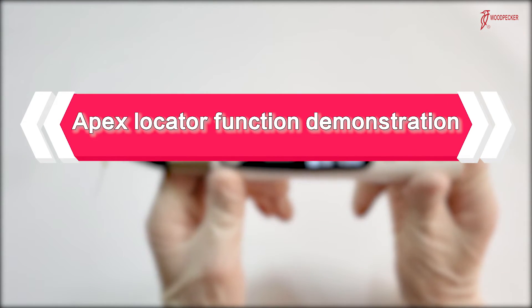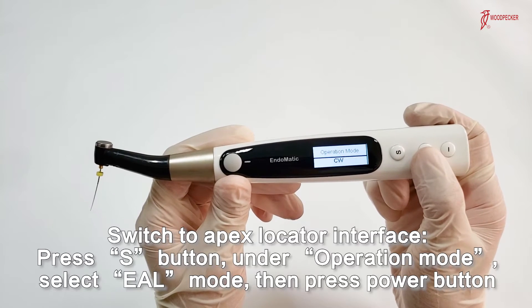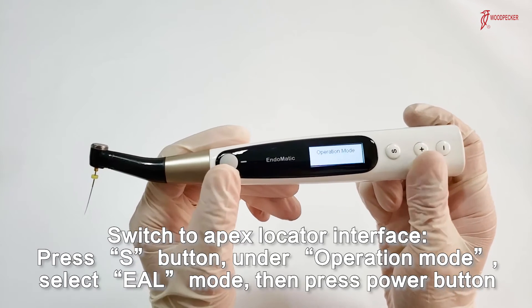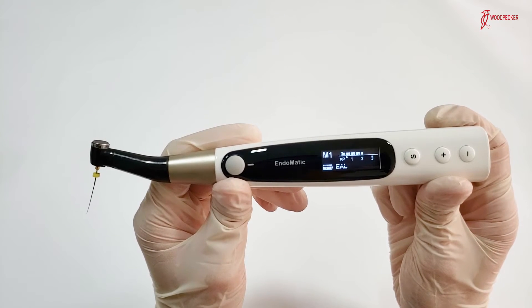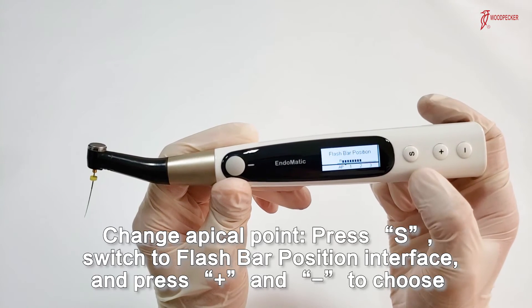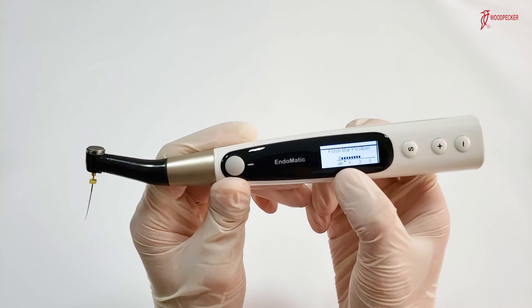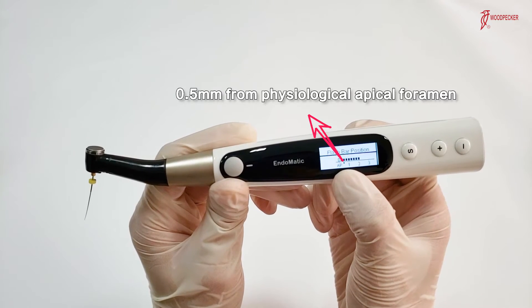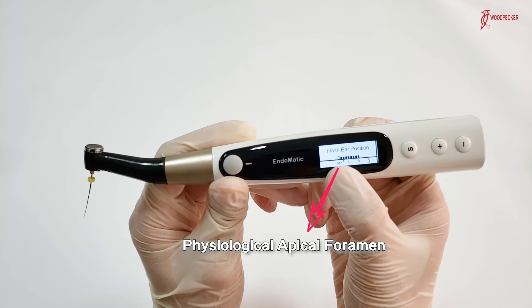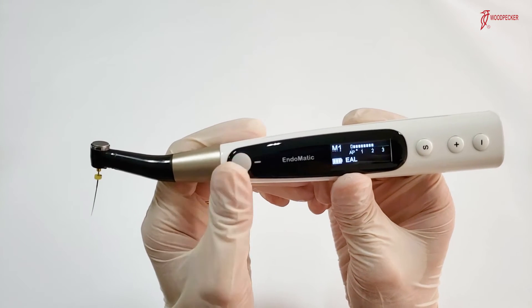Endermatic has an apex locator function. If you want to use only the apex locator function, press the S button under operation mode and select EAL mode, then press the power button. You will see the apex locator interface. To change the apical point, press the S button and under the flash bar position interface, press plus and minus to adjust according to your demand. Please look at this triangle icon — this is our suggested apical point, around 0.5 mm from the physiological apical foramen. The AP icon position marks the physiological apical foramen. Now select this apical point and press the power button.